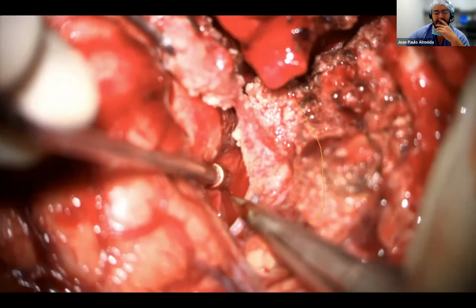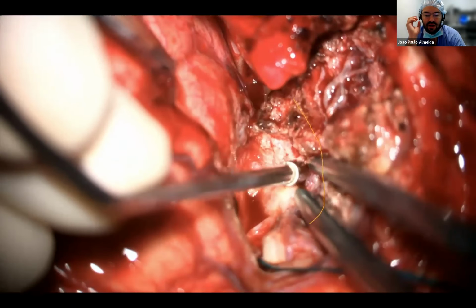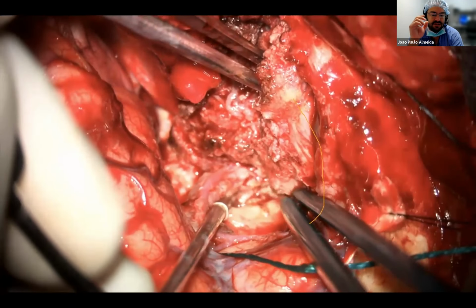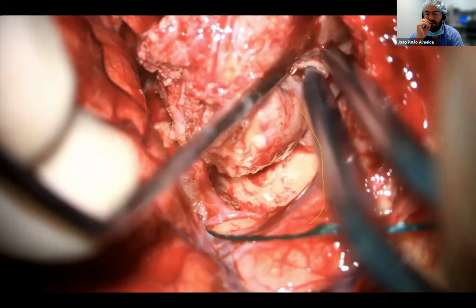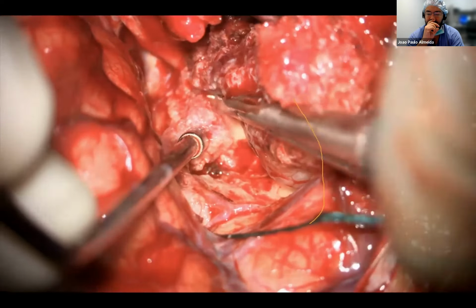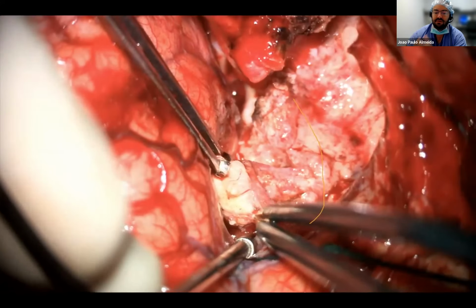So we decided, okay, let's get some tumor out. Let's get the big chunk of the tumor away, and then we can go back to see how much we can peel off of that vessel. Considering, of course, once again, he's 76 years old, and this pretty much looks like a classic meningioma, but for the swelling in the brain. More importantly, we don't want to give anybody a major stroke related with the MCA in that area.